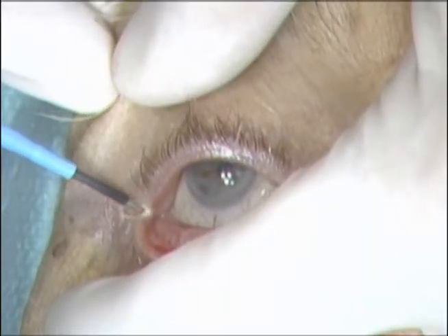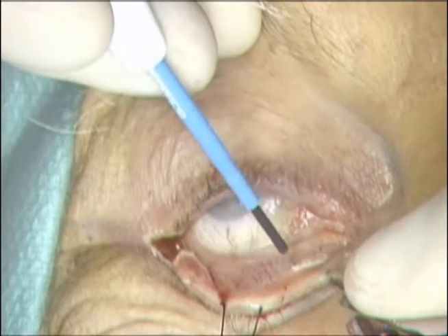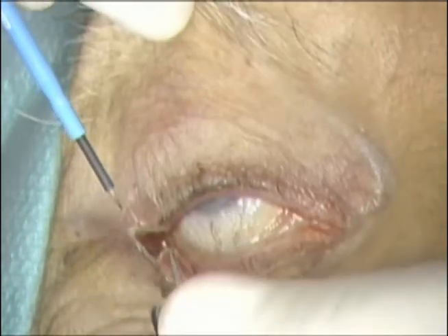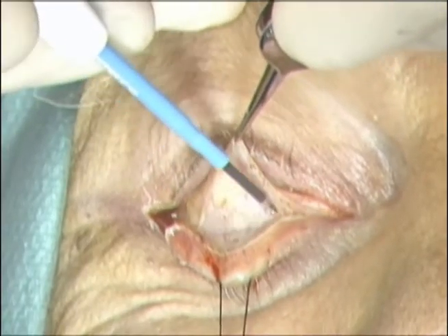A lateral canthotomy and inferior cantholysis are performed with the needle tip cautery. A transconjunctival incision is then performed with the needle tip cautery, extending from the punctum medially to the lateral canthotomy incision laterally, just inferior to the inferior border of the tarsus.